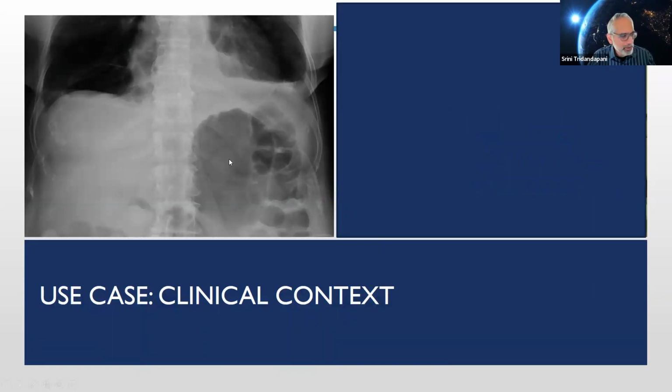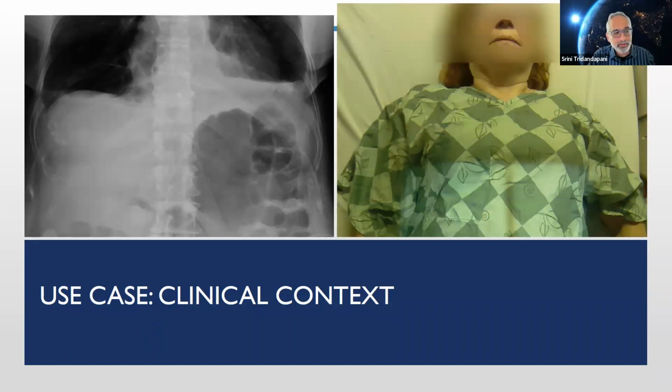And here was an example where they were looking for a feeding tube. We don't see the feeding tube. And now we wonder, well, is it coiled up in the lungs somewhere? Is it up in the neck? When they push it down the nose into the stomach, we don't see it. And so sometimes we spend 15, 20 minutes trying to track down the nurse or the physician taking care of the patient just to ask the question, do they have a feeding tube? And most of the time they don't know. By looking at the photograph, we can tell, well, there's nothing going through the nose or mouth, so I don't need to worry about it. I don't need to make this call. So it makes you more efficient. So this is a more positive use of the technology, not just finding errors.